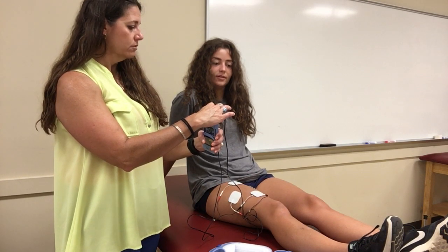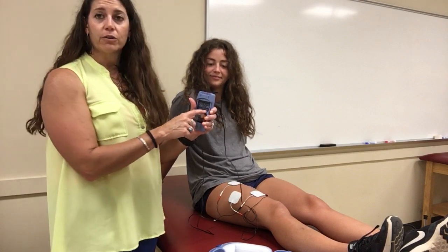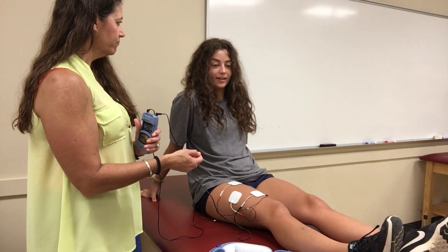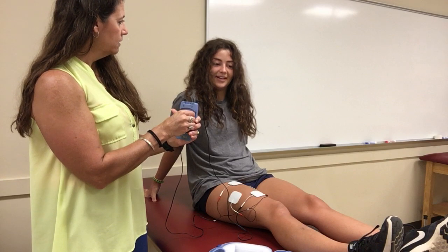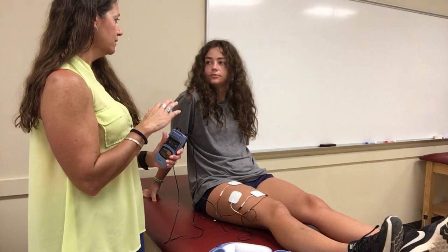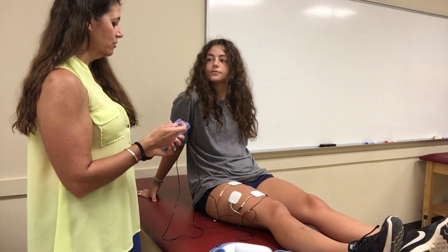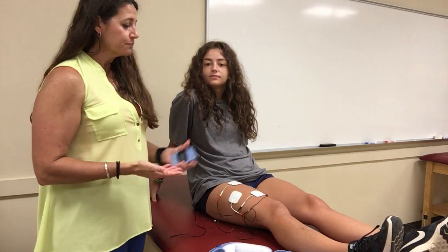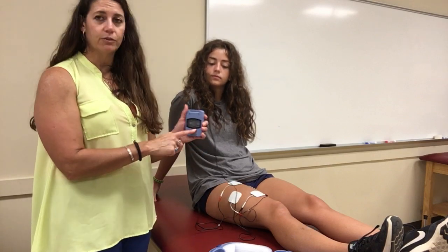Tell me before it really gets strong. She's at about a level two on lead one and the same for lead two. Then we can start changing the pulse rate. It's tingling and kind of buzzing — that's perfect. If I increase the pulse rate a little bit, does it feel like a stronger tingle? Yes, but it's not hurting and not making the muscle contract. Is it as much tingle as you'd feel comfortable having? Yes. All important questions to ask — don't put them in a position where they're uncomfortable. Then close it, and every five minutes come back and adjust the intensity. Once you max out the intensity, then you can look at changing the pulse rate again.